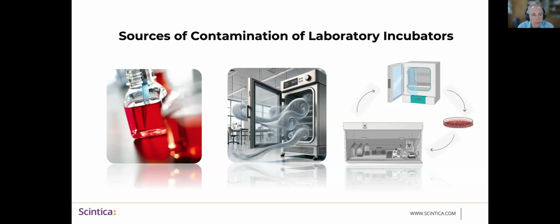Also, all of your media components that we indicate here on the left, serums, bovine serum, any supplements, everything needs to be, of course, contamination free. And this means you have to have a good incoming quality control protocol or have reliable vendors who have their own protocol for minimizing the possibility of contamination in the media components that they supply to you.